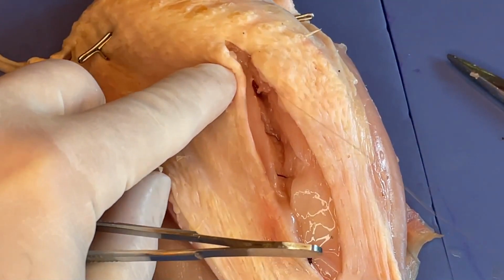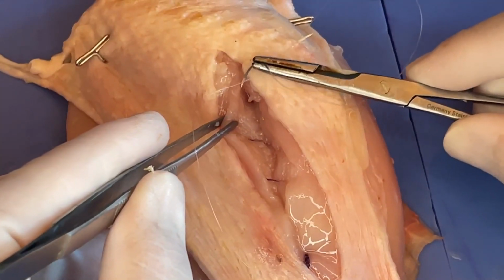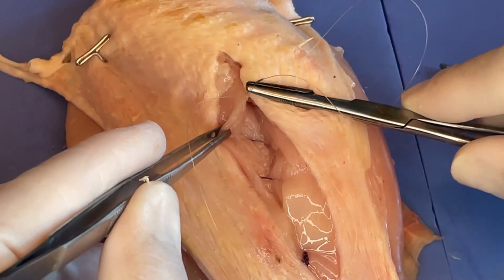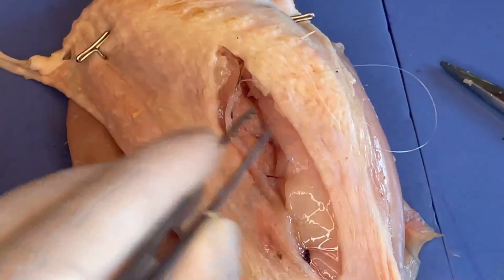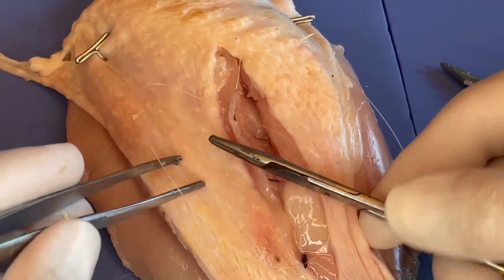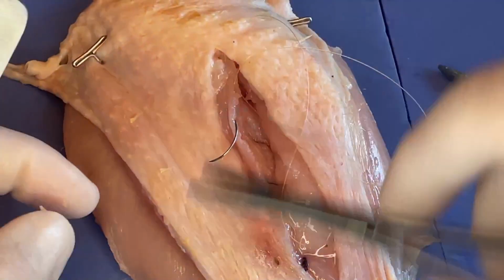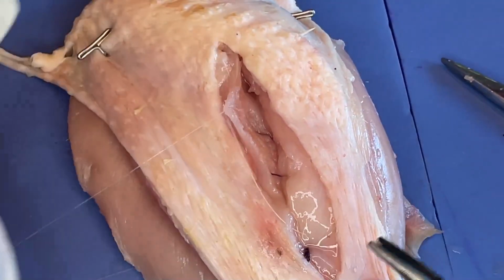So yeah, we're not really capturing skin, but we're getting kind of this very superficial closure. So we'll kind of treat this as skin. So just in here, travel down parallel to the skin edge, pop out right there, staying fairly superficial. And we're making sure to not lock this. My lighting here, of course, not quite as good as we've got in the ORs.